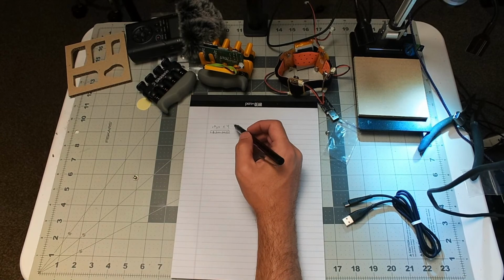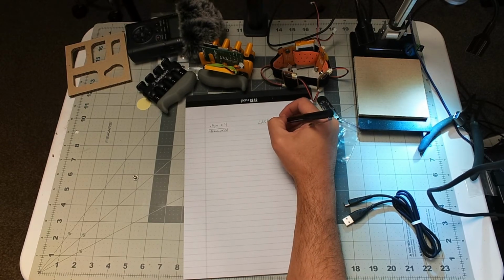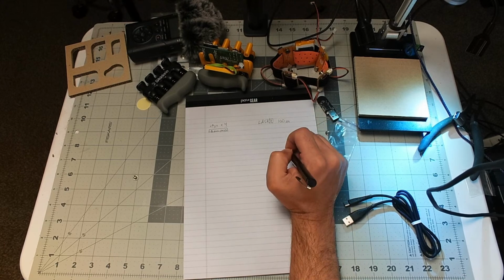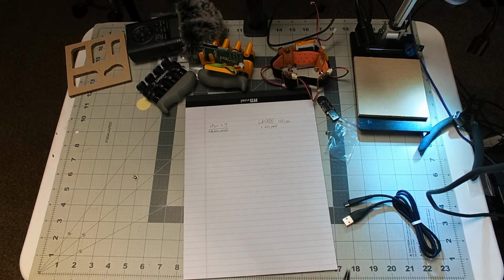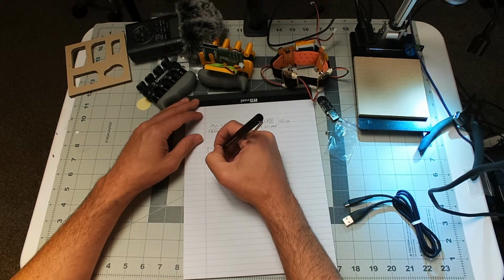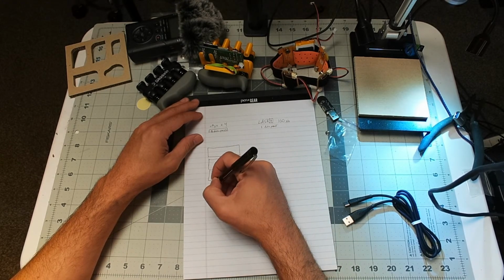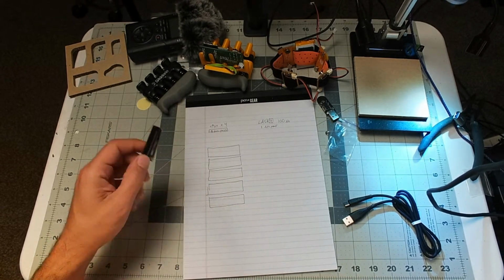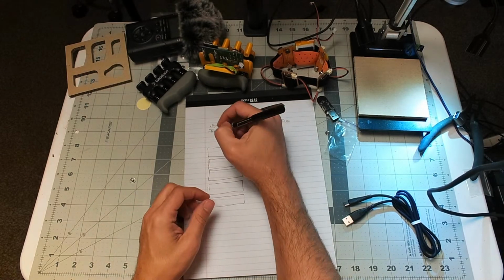And this will have a certain sampling rate, right? So the LASK system has 100 samples per second on each of the 4. And they're just individual. So they each have 1 data point. And I can't spell anything, which is fine. That's why I use auto check. So we're going to get a ton of packets with more data from uMyo. And let's count this. We need to count this rate. How's it going, Joe? So we're going to need to count this rate because we need to know the sample rate.